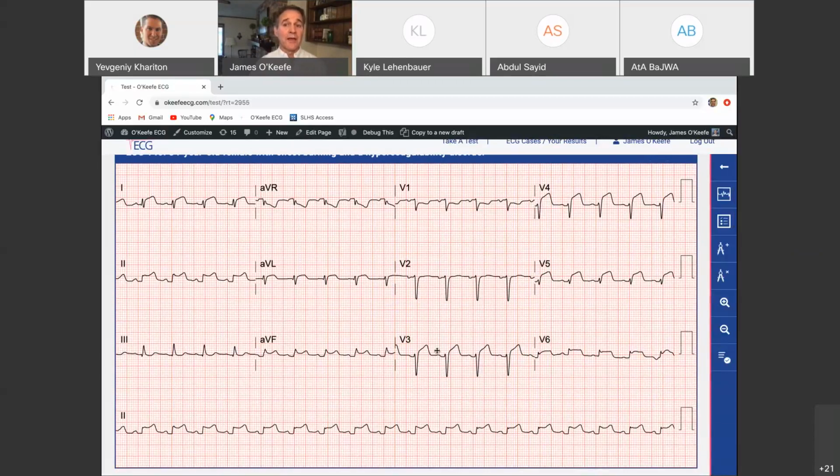that would be compatible with an anterior, because V1 to V3, two of the three, that would be anteroseptal. But on the boards, they combine anteroseptal and anterior, so two contiguous leads or more between V1 and V4 is anterior/anteroseptal. And then V5, V6 has more than 1 millimeter of ST segment elevation, so that's also an anterolateral infarction, and more than 1 millimeter in 1 and aVL, so that's a high lateral infarction. So in leads 2, but not 3, and aVF, there's also more than 1 millimeter of ST segment elevation. So do you think we should call an inferior infarction too?